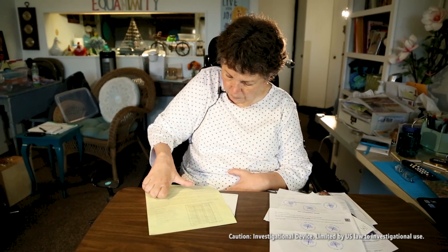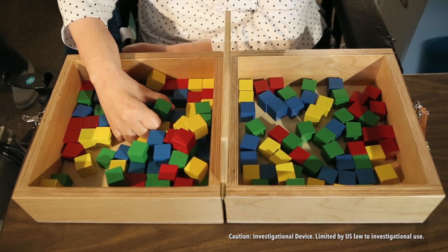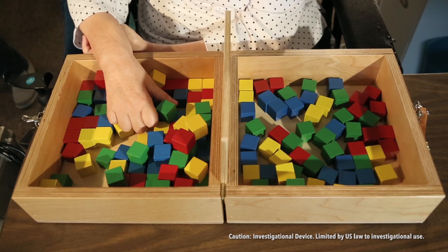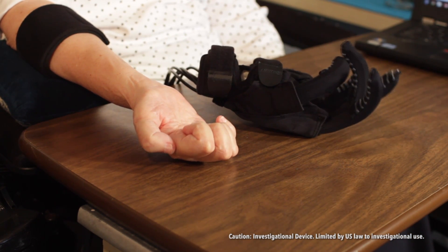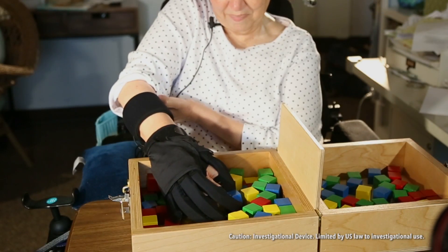We're developing a soft wearable robotic glove that could go on a person's hand, that would be useful for patients who have lost the ability to grasp objects. These could be patients with muscular dystrophy, ALS, or incomplete spinal cord injury. We're trying to create a solution that will allow them to be able to perform activities of daily living.